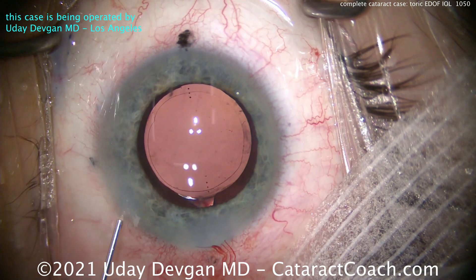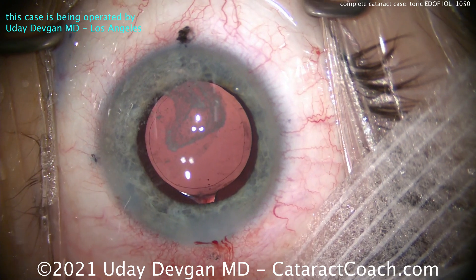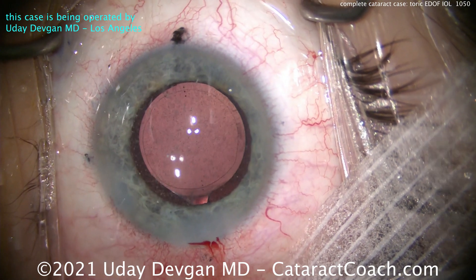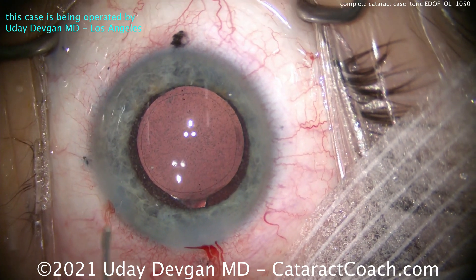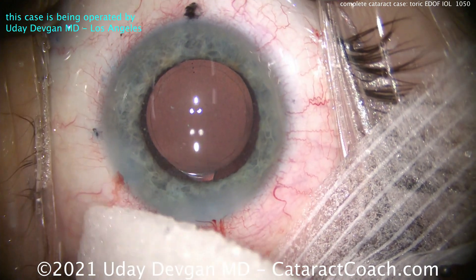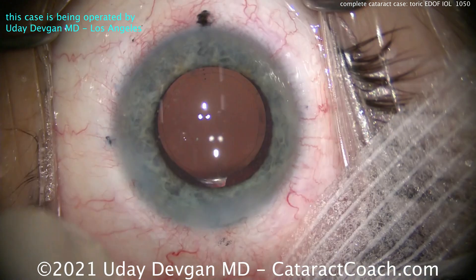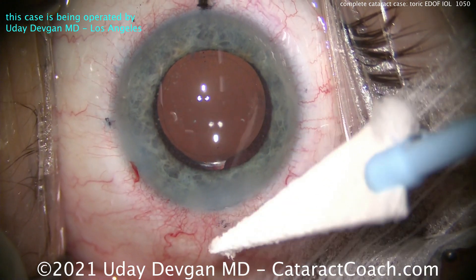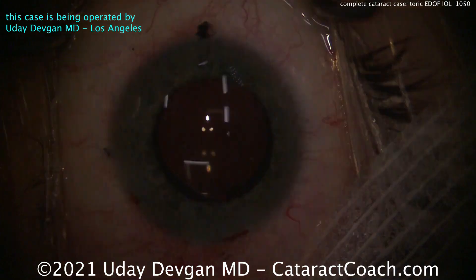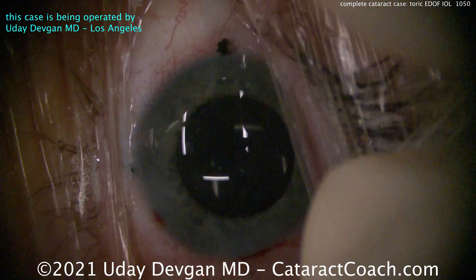We're going to put some triamcinolone in the eye — just about a half milligram — to help quell any post-op inflammation, and also a little moxifloxacin as an antibiotic to prevent infection. This is very important for a patient who has one really good eye. Let's make sure we do everything we can to get a beautiful outcome. Final step: we put some anesthetic over the incision, check that it's perfectly sealed — and that looks beautiful. I'm happy to tell you the patient had a beautiful outcome. Thanks so much for watching.